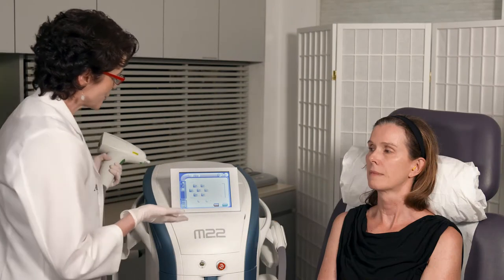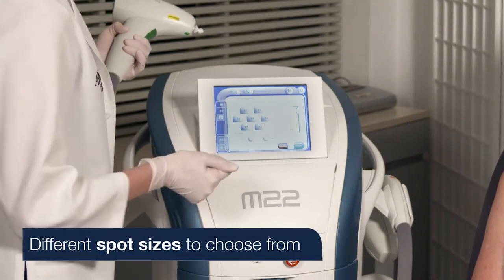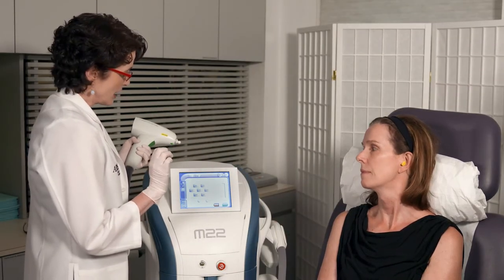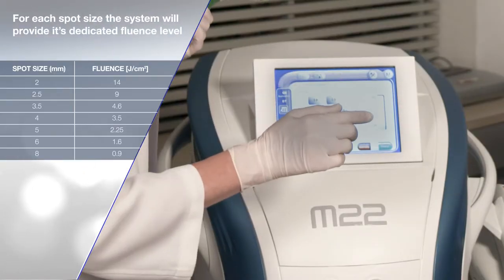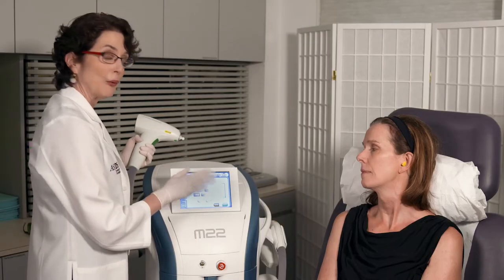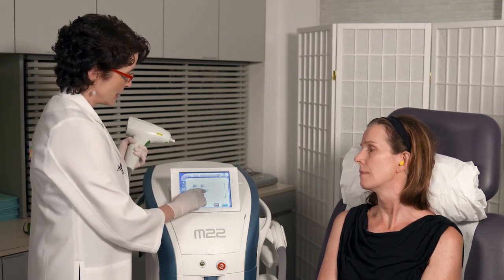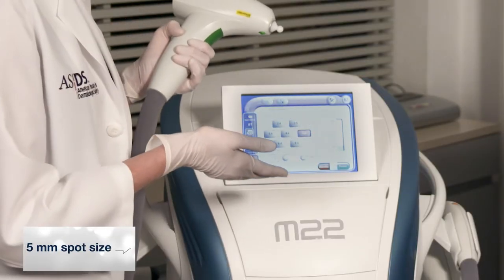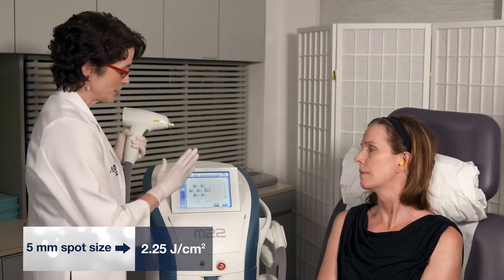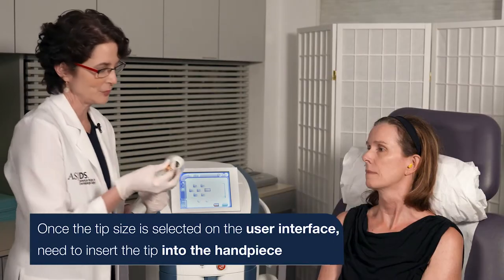I'm going to look at my screen — I have all these different spot sizes to choose from. Looking at Mimi, I want a low fluence. For example, I could choose the 6mm and the joules would default to 1.60, but I want a little bit higher. She's skin type 1 and can definitely tolerate this, so we'll go with the 5mm handpiece, which sets the joules at 2.25 joules per centimeter squared. I'm going to take out the spacer and put the 5mm in.